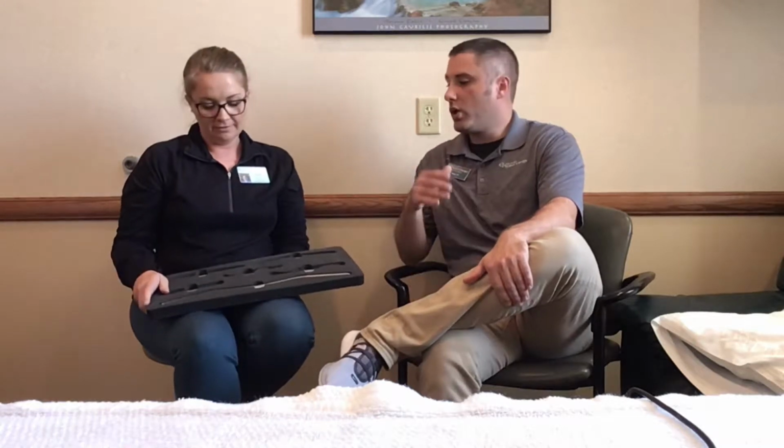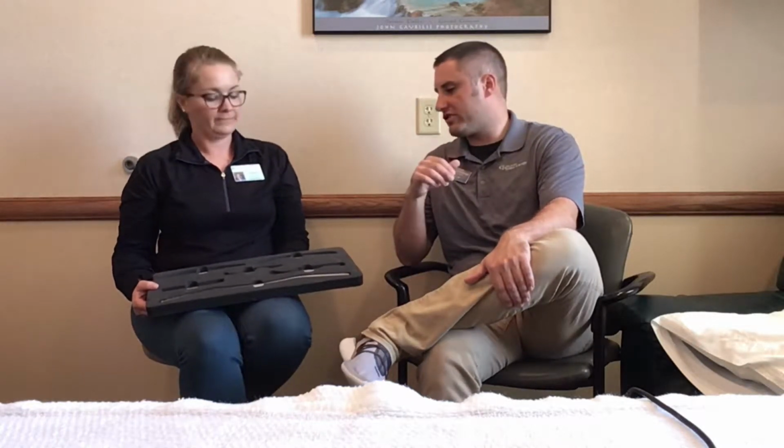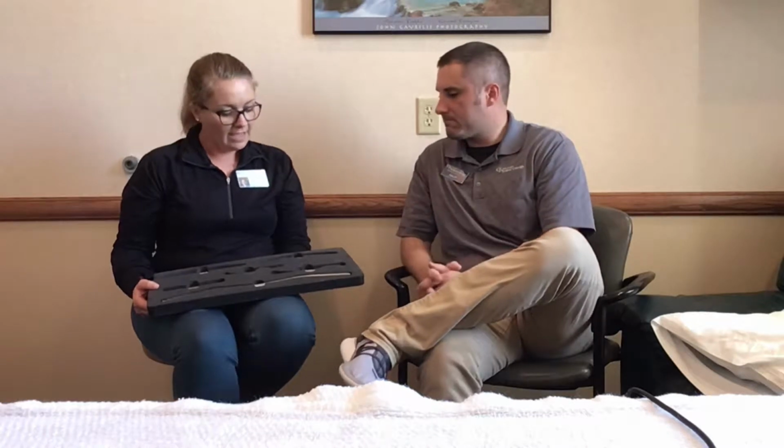Awesome, very good. So what kinds of conditions do you treat with this? So the main thing is just any tight muscles or a large area that I want to get to. I can do these just as I could a massage, but this gets in deeper and quicker. The other things that are very good for are tendonitis, like I was just telling you with the kneecap or the feet, to really get in there and do a cross friction massage to get that area relieved. Some of these tools are good for helping get shoulders moving better. On bigger people that can't do traction on their necks, this one works wonderful.